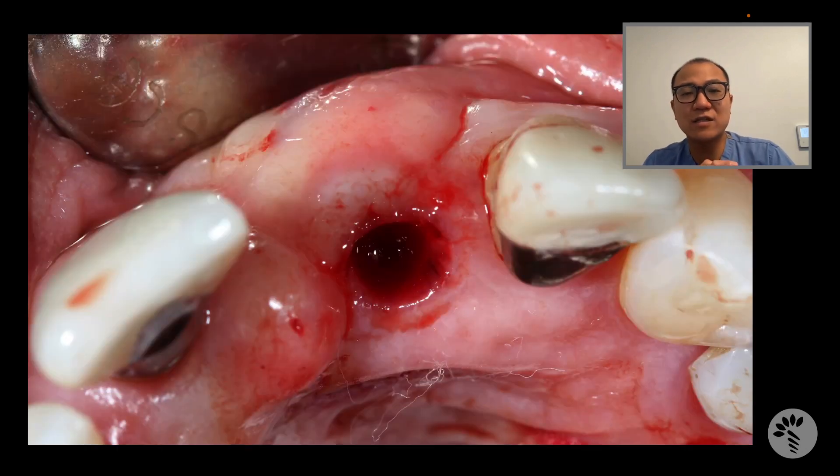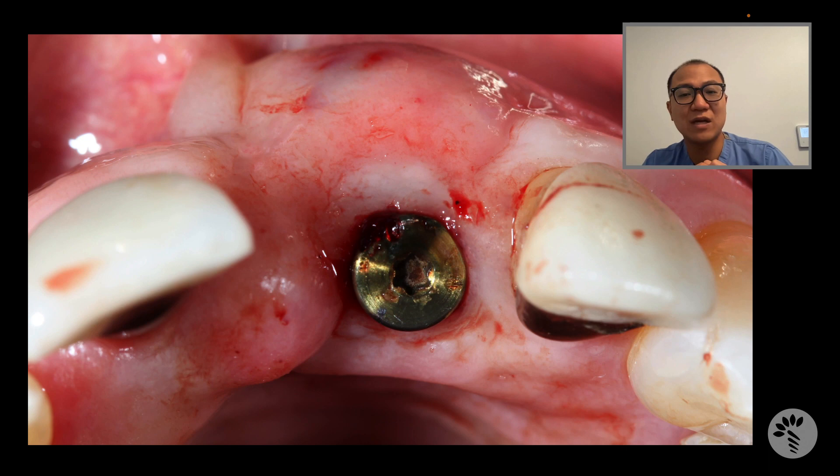Once the graft is inserted into this buccal emergence pocket, you don't need any stitches. All you need is to put the healing abutment back, and you have a completely sealed surgical site. Look at the immediate postoperative emergence — you can see the buccal area is now more convex.